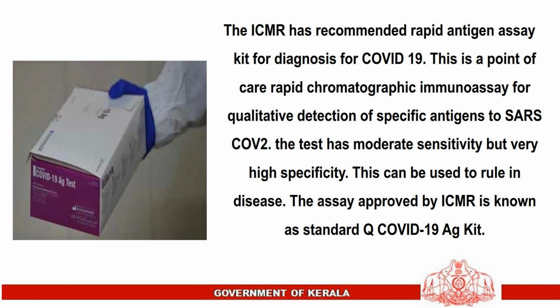The test has moderate sensitivity but very high specificity. This can be used to rule in disease. The assay approved by ICMR is known as Standard Q COVID-19 AG kit.